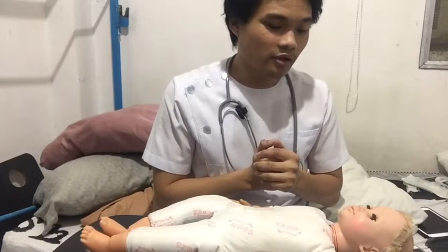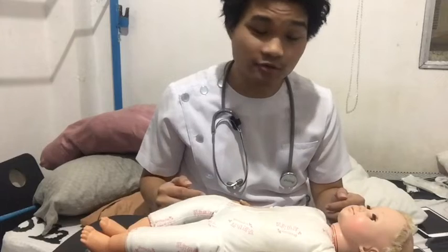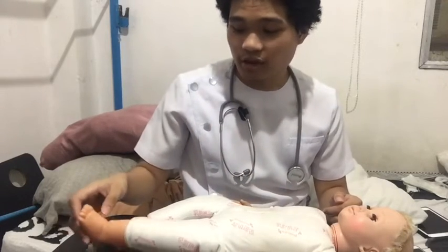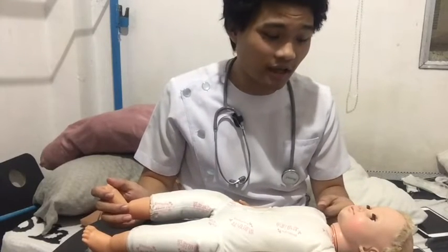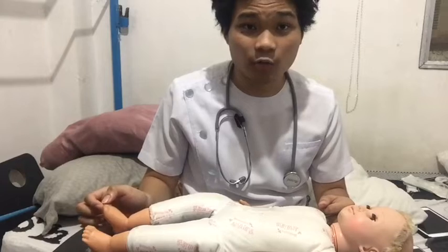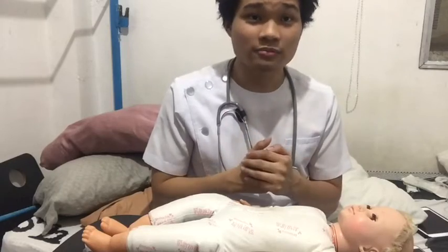After verifying our client, we're going to be assessing the client's vital signs, which revolve around the respiratory rate, the heart rate, as well as checking the pulse oximeter reading of the baby. The purpose of this is so that we can have baseline data for when we're going to be comparing before and after the medication. So this is how we're going to be starting the procedure.